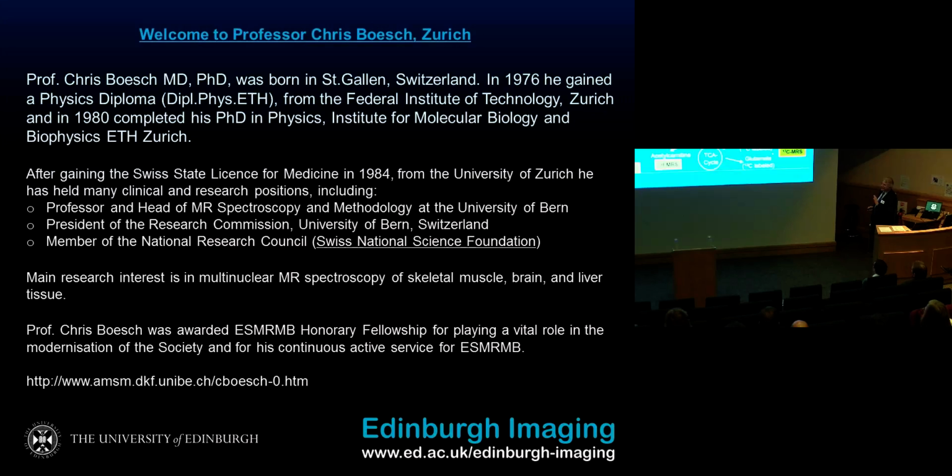Lipids can be in adipose tissue, and we have the opportunity to look at it with imaging, with carbon-13, with proton MRS. The ectopic lipids, IMCL, IHCL, so intramyocellular lipids, intrahepatic lipids, intracardial lipids, intrapancreatic lipids, we can look at with proton MRS and also MRI. Membranes can be characterized by phosphorus spectroscopy, and choline can be looked at by proton MRS. So you see a full view of all the different pathways is possible.